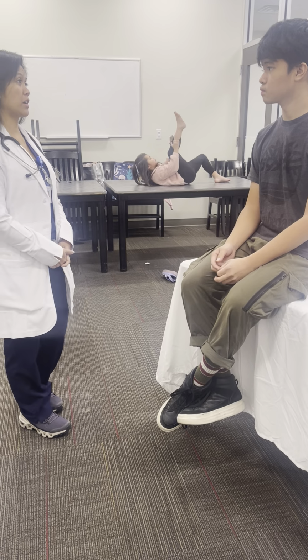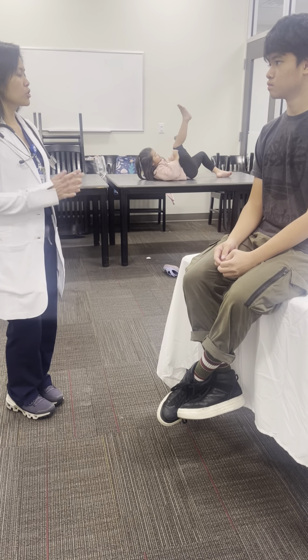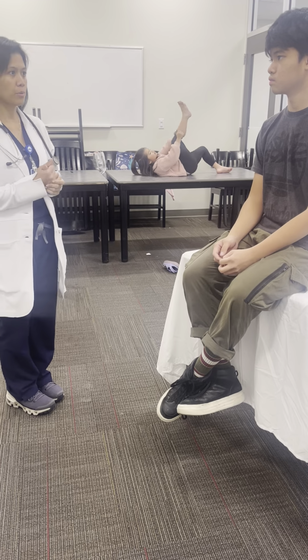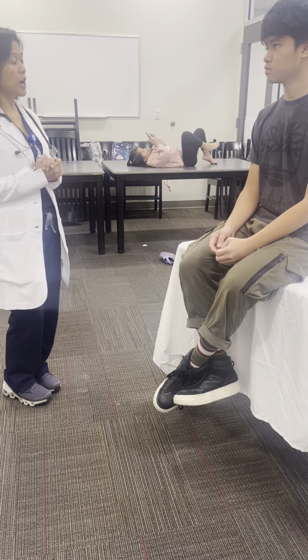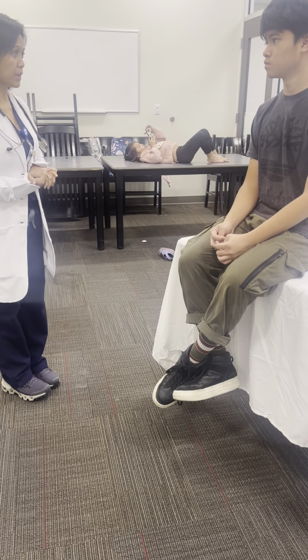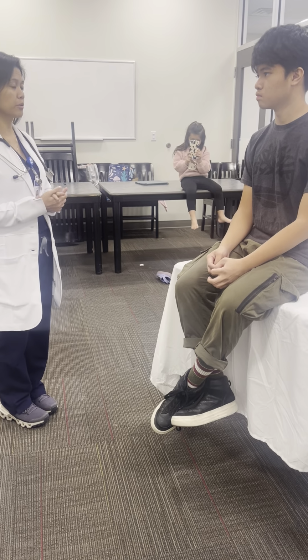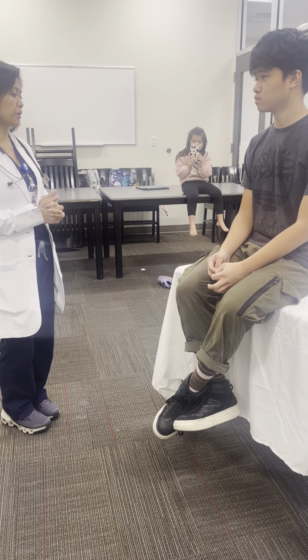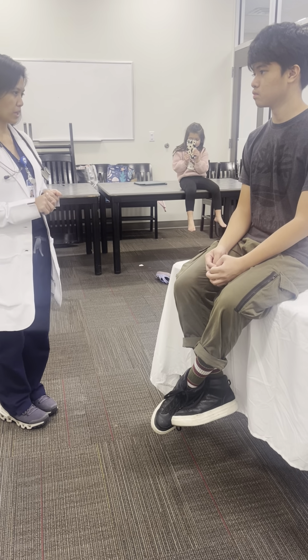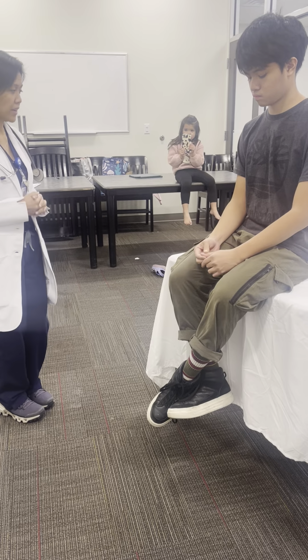I'm going to conduct a head-to-toe assessment with you. I already washed my hands with soap and water. Prior to doing your assessment, I would like to take your vital signs. I will take your blood pressure, respiration, your heart rate, and your oxygen saturation. And we're just going to pretend that I'm going to get your temperature as well, okay? Thank you.